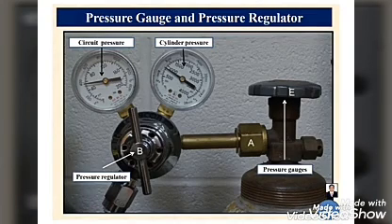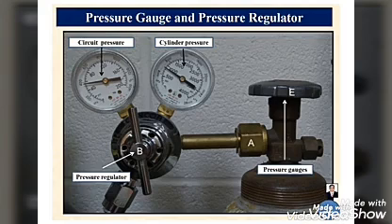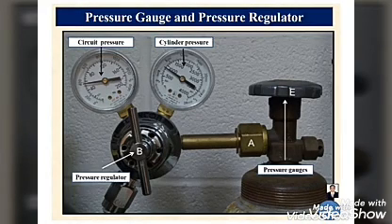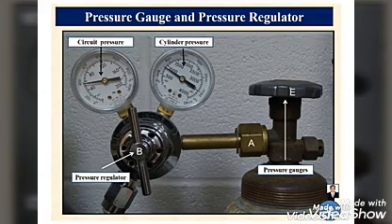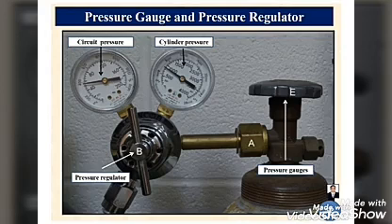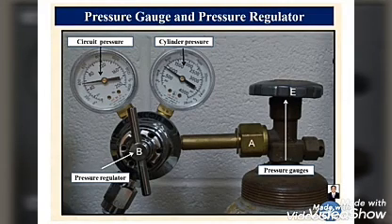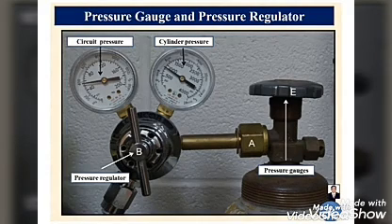So this is the pressure gauge, a calibrated pressure gauge with a valve fixed on top of the oxygen cylinder, and it displays the pressure of the oxygen in the cylinder. It rotates anti-clockwise to open, and clockwise to close. So anti-clockwise is open and clockwise is close. How much oxygen is present inside the cylinder is displayed by this first dial. So this dial displays the pressure of the cylinder.